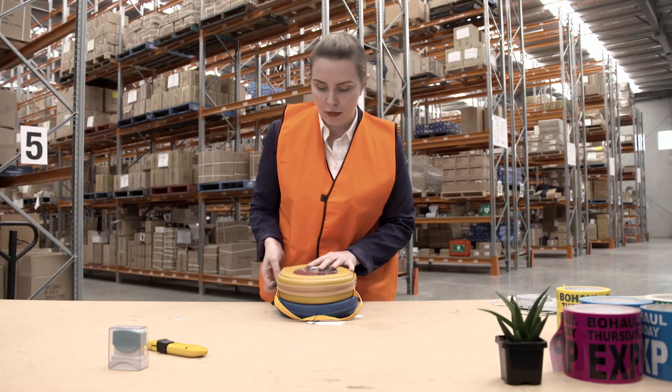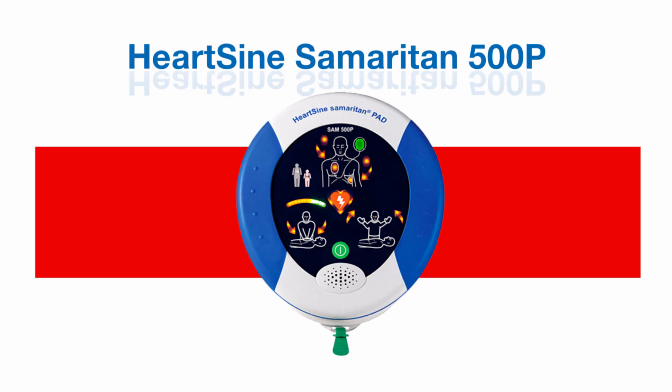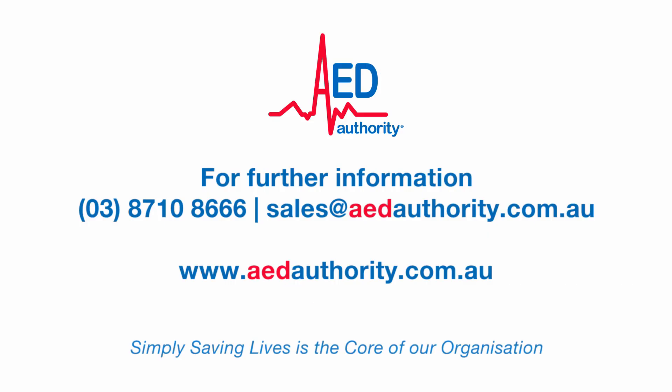To ensure your defibrillator is working, once a month simply check the light is flashing and you can rest easy knowing your device is ready to go in an emergency. AED Authority Australia is the leader in sales and management programs of defibrillators. Simply saving lives is the core of our organisation.